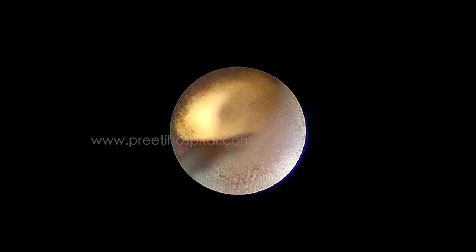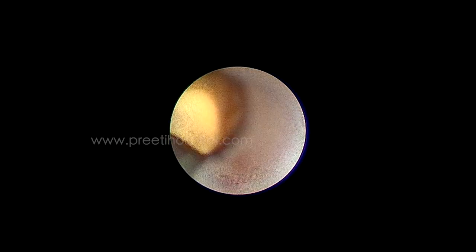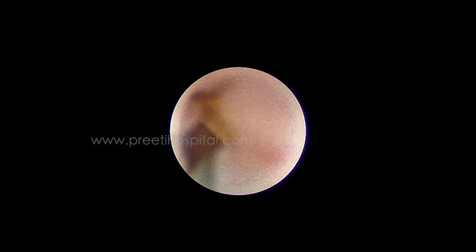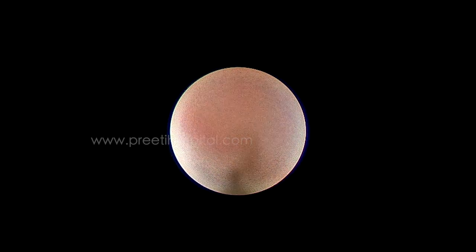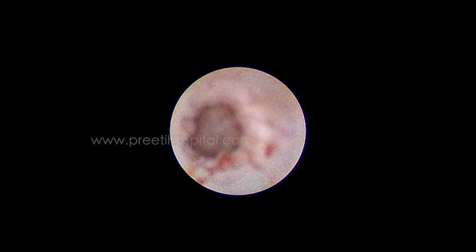I have negotiated and I have seen the stone. Now after that I am realizing that the scope is not at all moving — totally snugly fitting. What can I do? I cannot control the laser. If the scope is so tight, I push back. RIRS I cannot do. So for all the juniors, at this stage do not get tempted for ureteroscopy or RIRS, because there are two kinks and a very tight ureter.